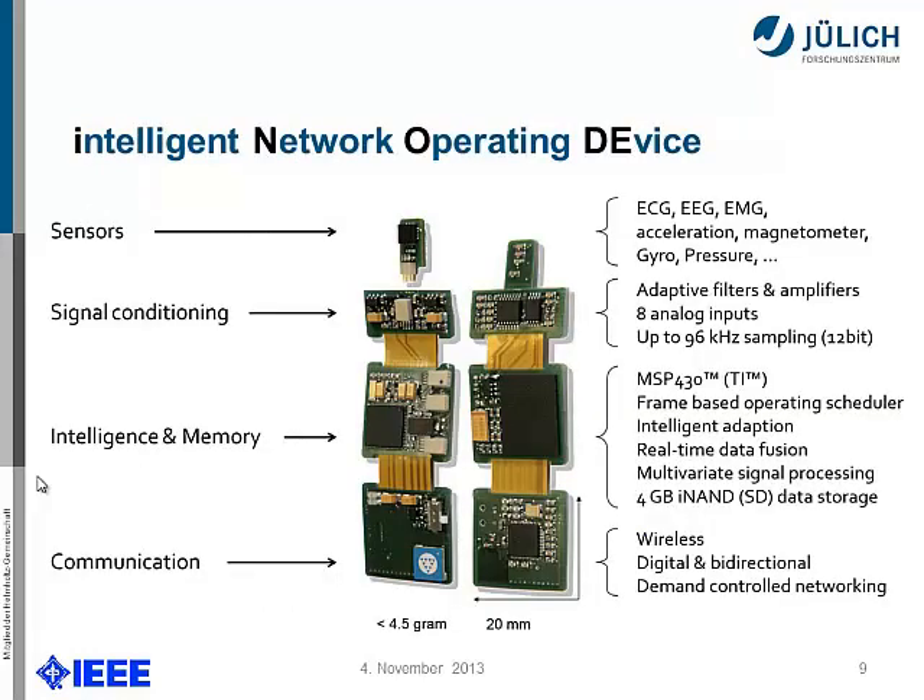Here's the DAQ platform we have been using for several years. We have sensors on top; we've already implemented many sensor front-ends including ECG, EMG, and all standard sensor front-ends — gyro and intelligent sensors. After that we have signal conditioning providing different voltages, and the central intelligence: a Texas Instruments MSP430 for low power. We have flash memory on the backside and can use a micro SD card, so it's very flexible. At the bottom we have the wireless unit using an IEEE 802.15.4 standard device.